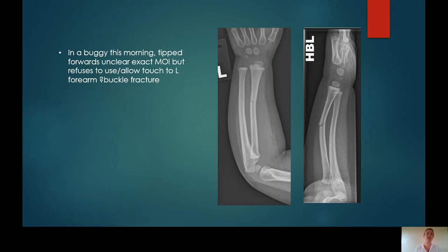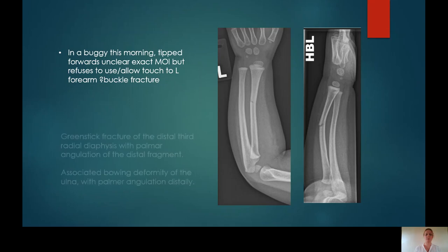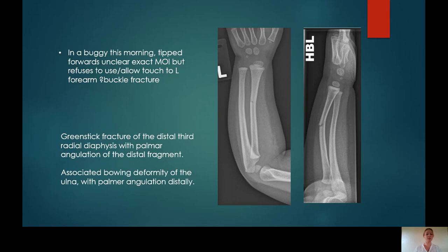Case 5: In a buggy, tipped forwards, unclear exact mechanism of injury, refuses to use or allow touch to left forearm, query buckle fracture. This is an example of a greenstick fracture of the distal third radial diaphysis, and also a bowing deformity of the ulna. If you really follow that ulnar contour of the whole bone, especially on the lateral, you'll see it actually bends — much more than it should. Another example of a subtle bowing deformity.